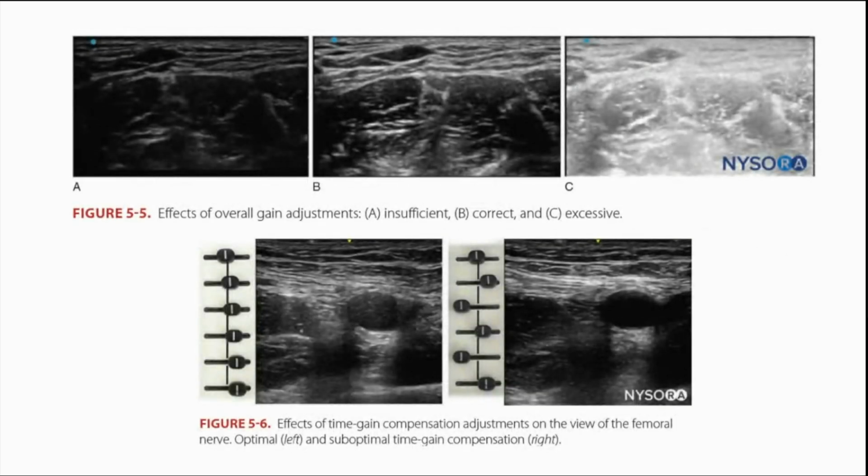This is a picture to compare the different overall gain adjustments: there's not enough, just nice, or if there's too much. And this, on the other hand, is for time gain compensation adjustment. This is just nice, this is, sorry, this is not enough.